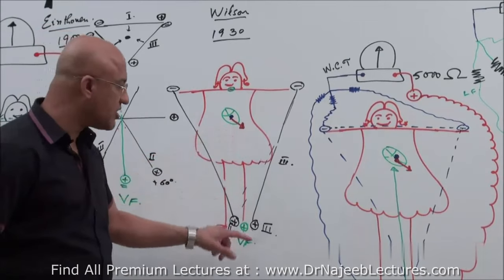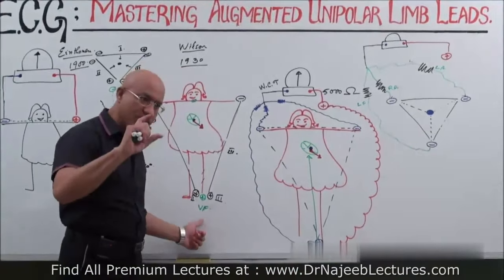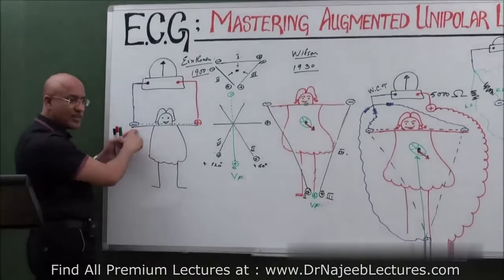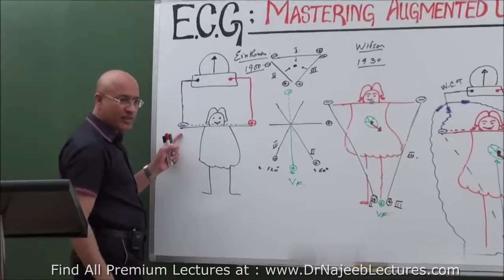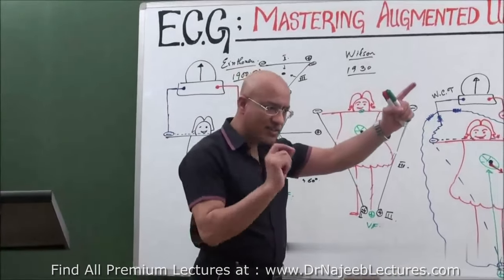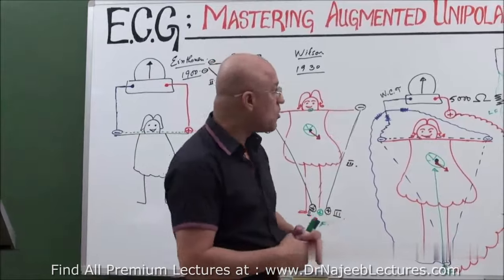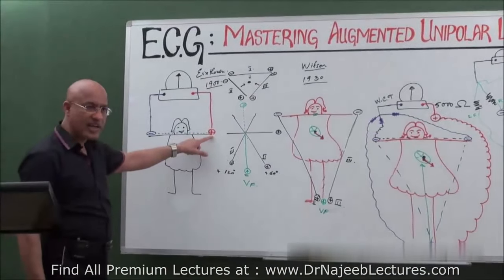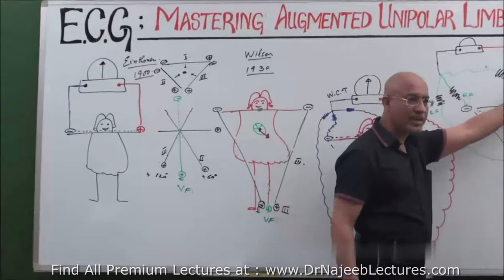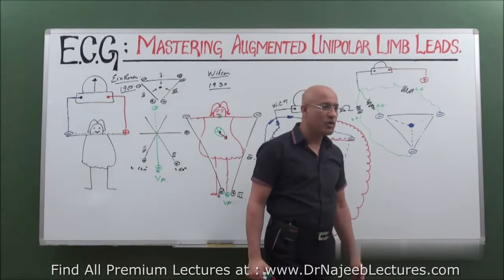The total voltage sensed by this electrode is significantly reduced as compared to the bipolar leads. As you know, if one pole is positive and the other pole is negative, there is a real electrical difference. But if one pole is positive and another is an indifferent pole, will the voltage differential be more, moderate or very less? Very less. When the positive electrode is detecting the potential difference relative to the negative electrode, there are good voltages. When it is detecting voltages against the indifferent electrode, the voltage will be very less.